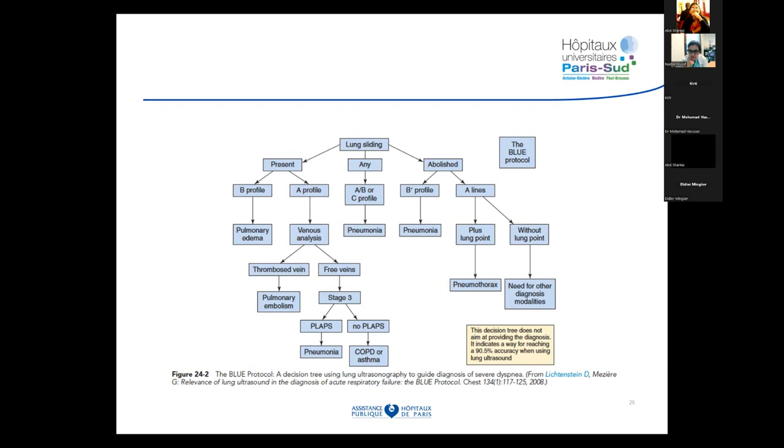We had one such patient presented in the beginning, trying to see how we can titrate this, because when we have signs of pulmonary overflow and poor thriving, then we're kind of in a vicious circle. Or maybe we're moving on, like in trying to evaluate, for example, a persistent duct. Difficult to say. I mean, the question here is not should I treat or not, because we have 27,000 opinions on that. But the question is: do we have pulmonary complications related to this overflow? We can follow that up and see the progression towards B-lines or B profile, or on the other hand, see whether we should take this into account when we decide how we manage the patients.